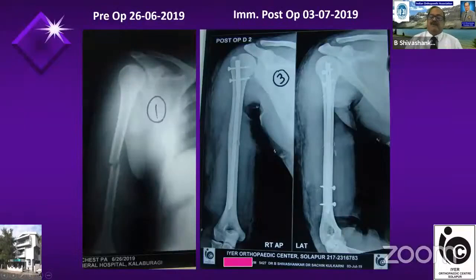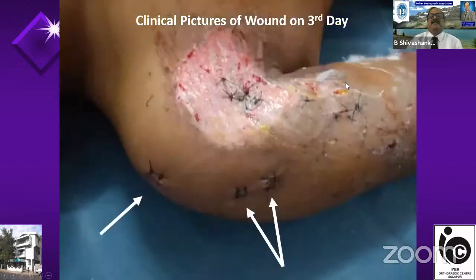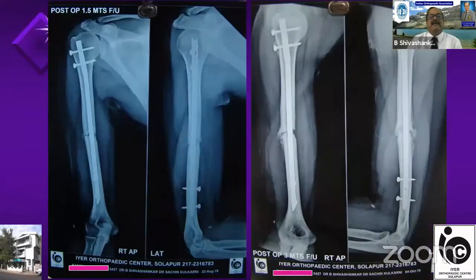This is the immediate post-operative picture in the same patient. And this is on the 3rd day when I took the patient for dressing. The wounds have started healing. You can see the wounds where I have put the stitches. Then at the 10th day, when the patient came for stitch removal, this was the condition. And I did the stitch removal on the 10th day.